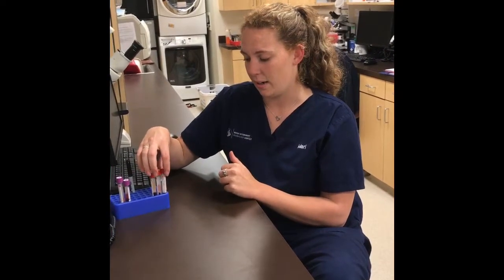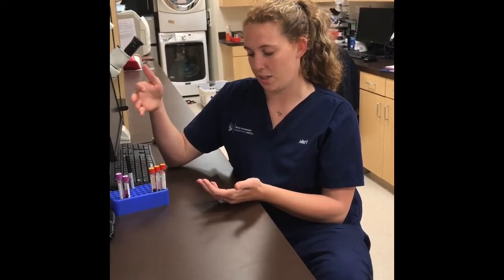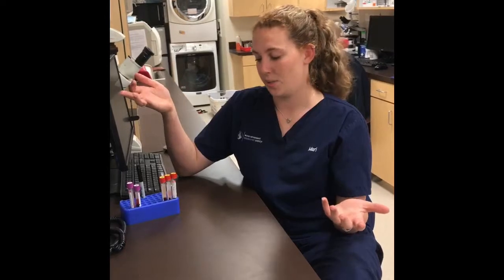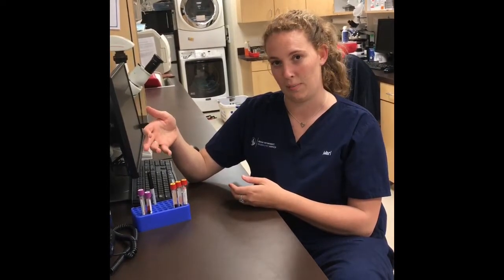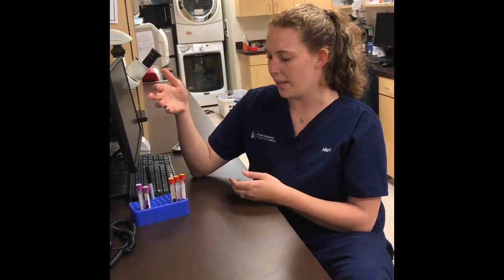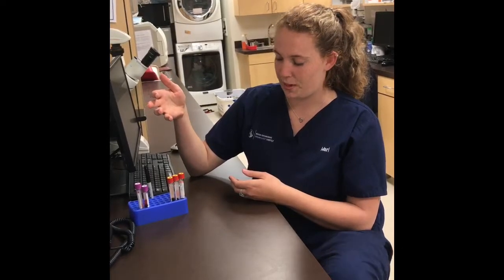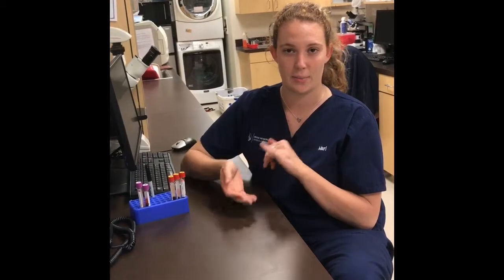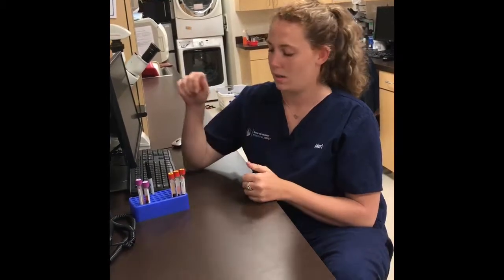When hemolysis occurs, you are actually damaging your red blood cells, which in turn is releasing constituents that are normally intracellular into the extracellular fluid, which can dilute your sample or falsely increase your values in the intracellular constituents as they're now in the extracellular fluid where they would not normally be. It can interfere with values such as your lipase, bilirubin, phosphorus, potassium, or your enzymes.